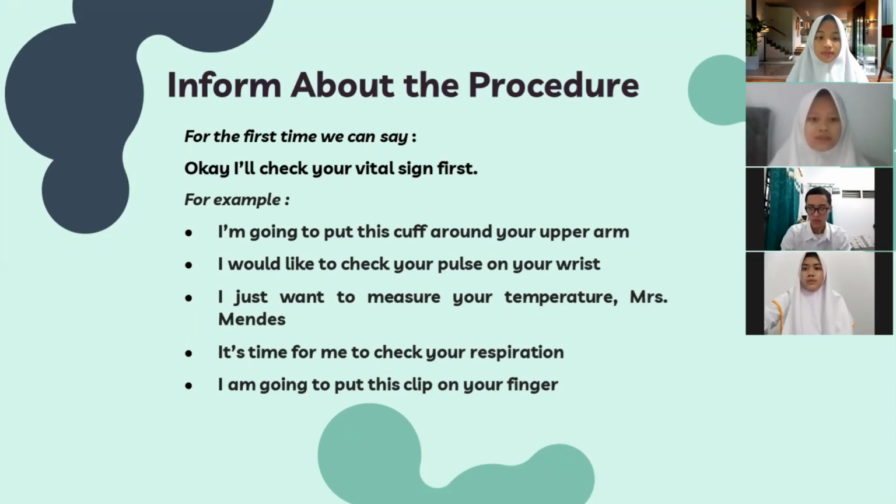I just want to measure your temperature, Mrs. Mendes. It's time for me to check your respiration. And the last one is I'm going to put this clip on your finger.